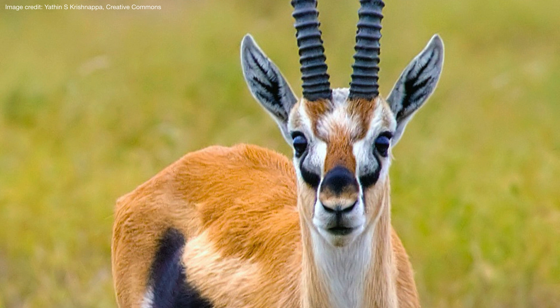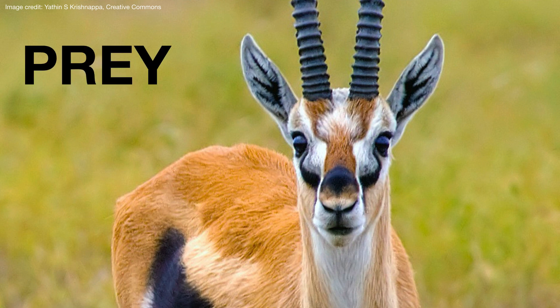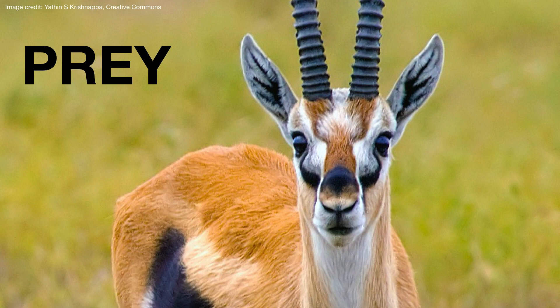Desaturation, hypotension, loose connections — you are on the lookout. You could call this prey mode.